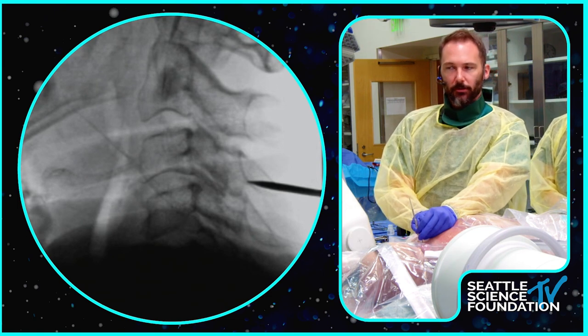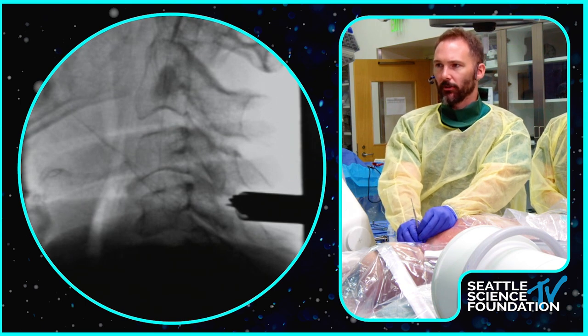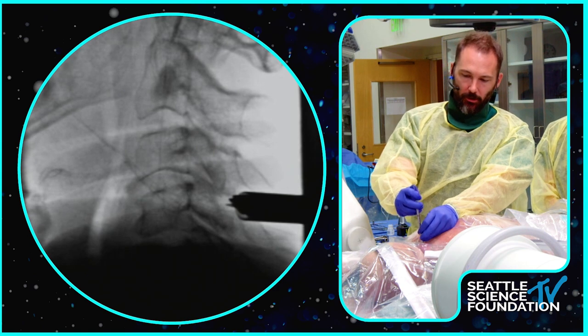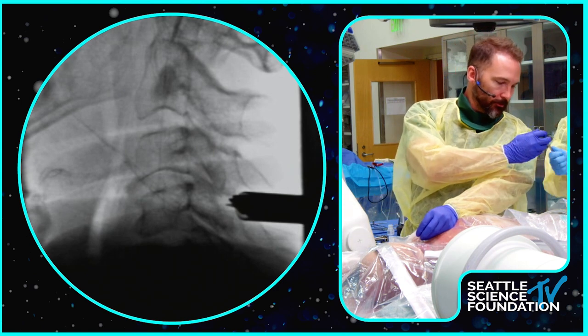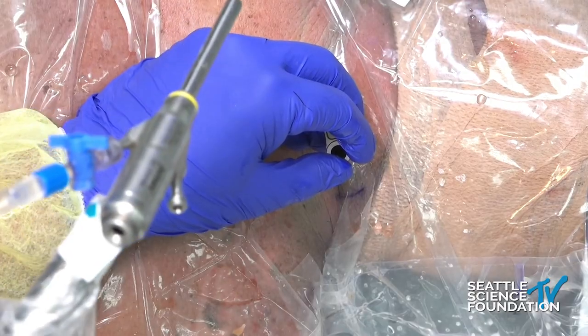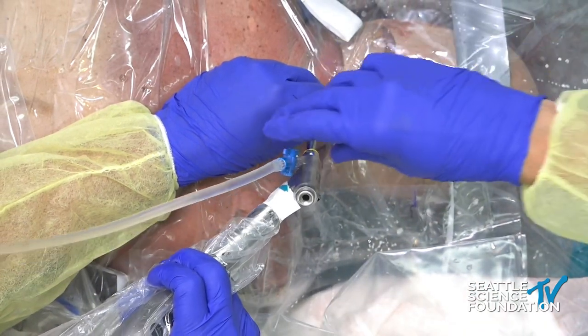Taking another lateral shot. Our target level is C3-4. Everything looks pretty good. I'm going to take out the dilators.